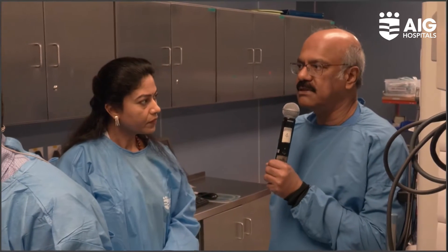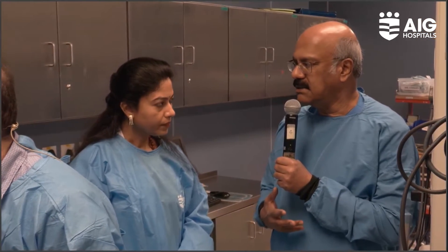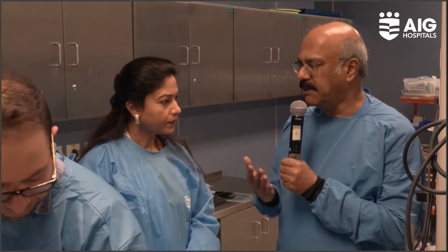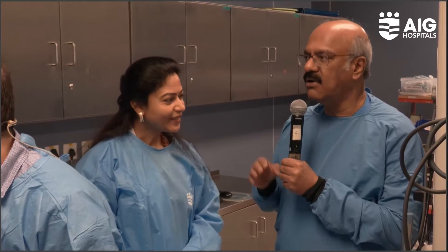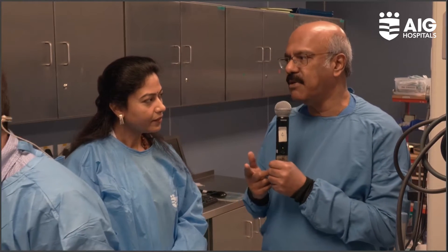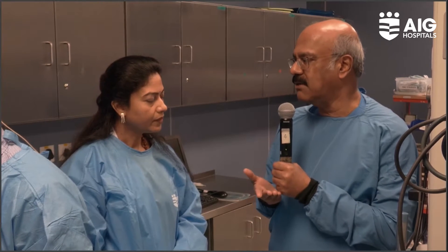I have a question: with this machine, do you think the role of the pathologist will diminish? It looks so clear to interpret — maybe Sandeep and Mohan can look at it and say malignancy or not. Is it also possible to transmit this to a mobile phone so that wherever the pathologist is, they can see on their phone and get back with the report? Pathologists can become very busy nowadays with so many specimens coming in.